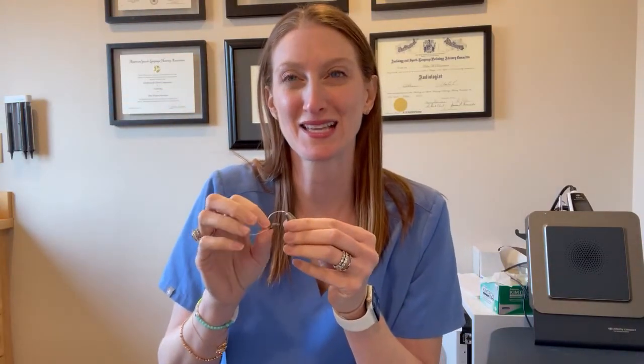Hi, it's Dr. Rhee, and today I'm going to teach you how to clean your hearing aids like a pro. Most of my patients wear receiver in the canal technology, which is the style that goes behind the ear, and then there's a small piece that goes into the ear canal, much like this. So what I'm going to show you today is how to clean your hearing aids like a pro.